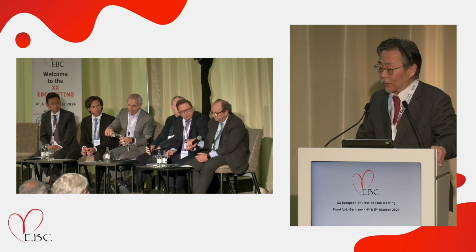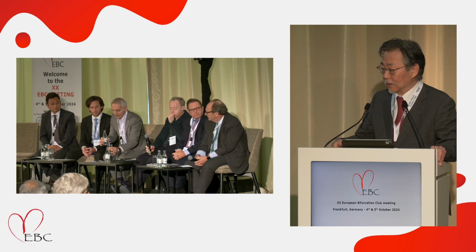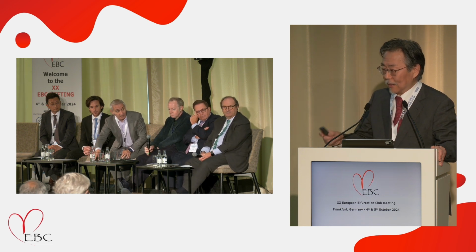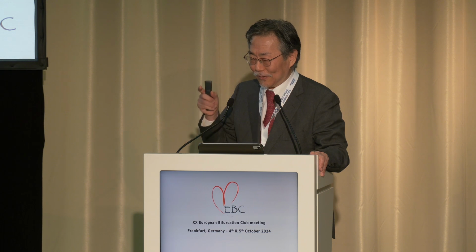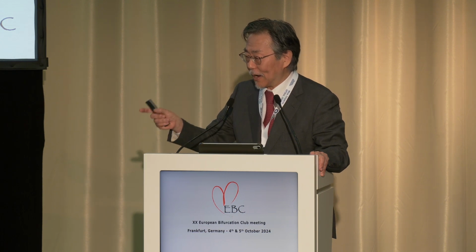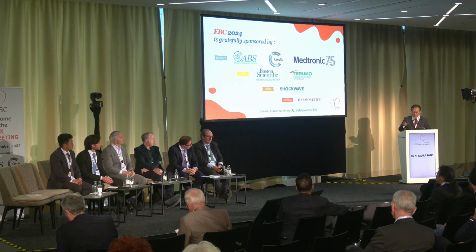Yes, totally agree. Intracoronary imaging interpretation is very important, especially in the 001 region. The 001 region alone is very rare. According to the imaging study, consecutive plaque exists in the proximal main vessel.